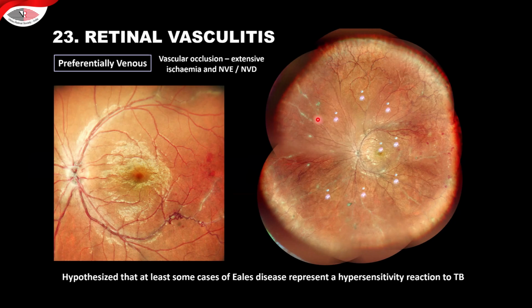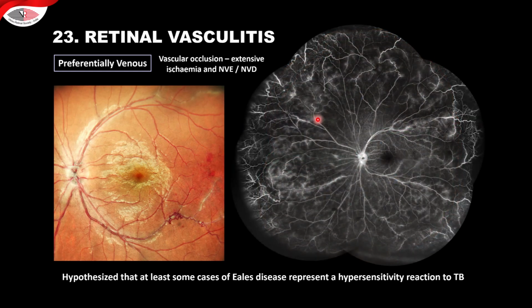So it's best to identify them at the earliest, and then start to treat them. We always have to reduce inflammation. In these cases, steroids work to reduce inflammation, but to do more finite treatments, you need to document angiographically any CNP areas, any neovascular areas, and treat all those lesions with lasers so that no neovascularization happens in these patients.